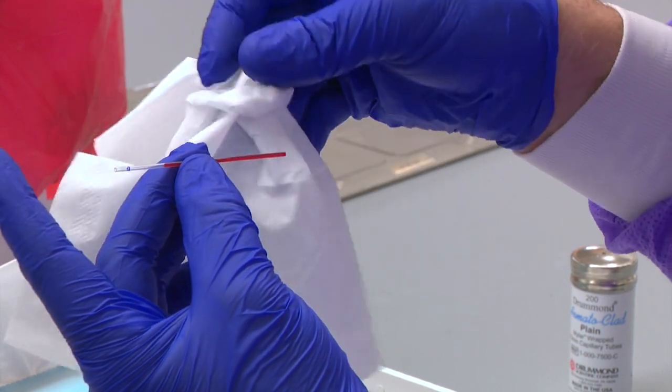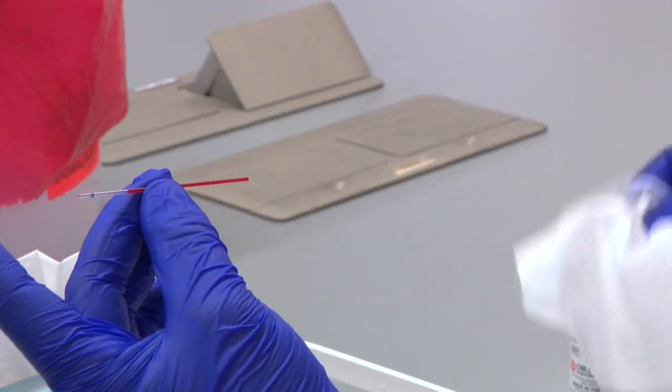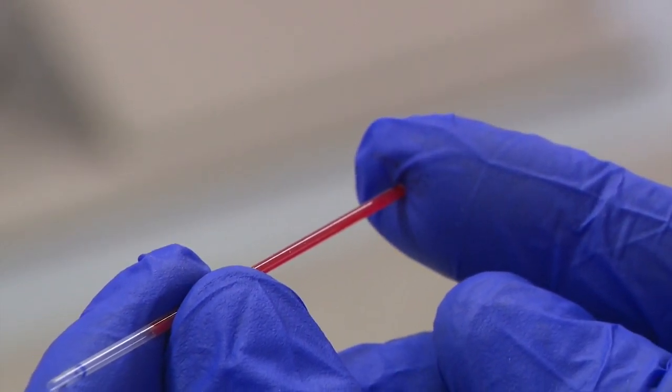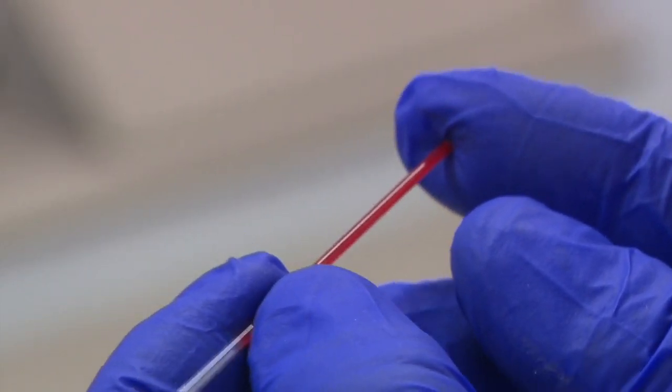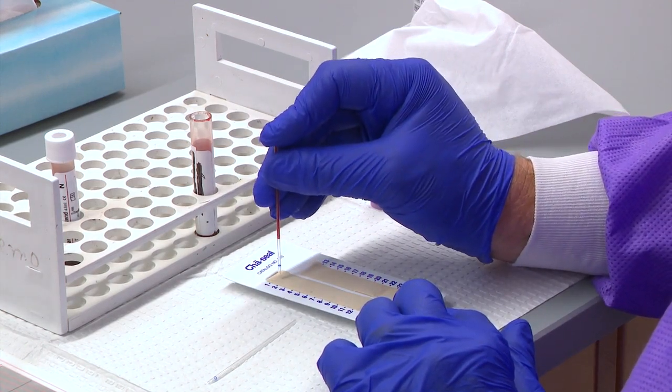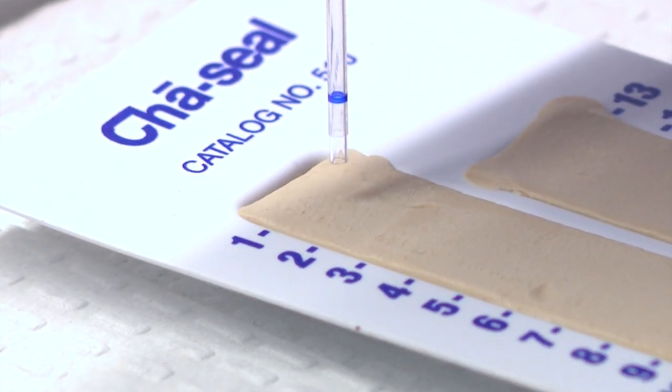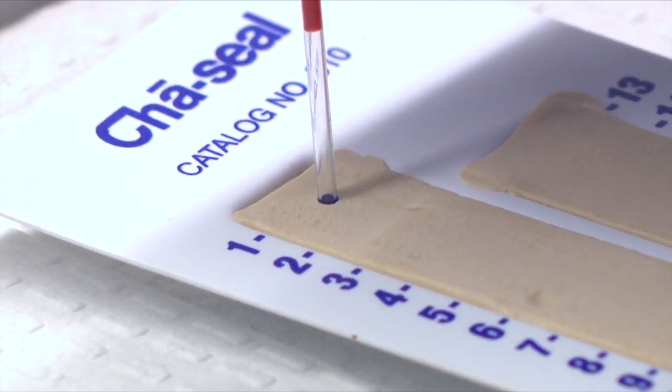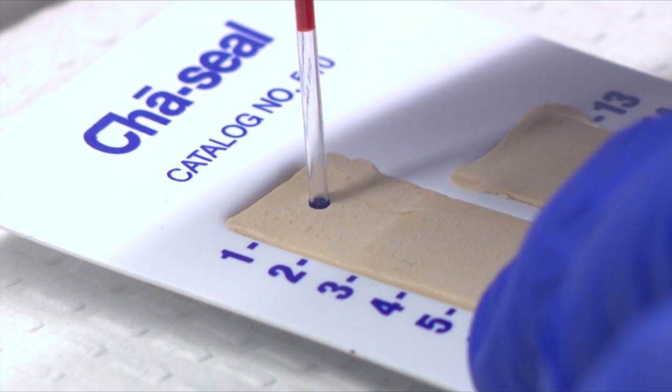Hold the micro hematocrit tube horizontally and wipe off the wet end with a Kleenex. Place your finger over the wet end of the tube. With your finger capping the wet end, rotate the tube vertically with the dry end down and push this end into the clay. Repeat this step a few times so there is a good amount of clay in the tube to plug the dry end.